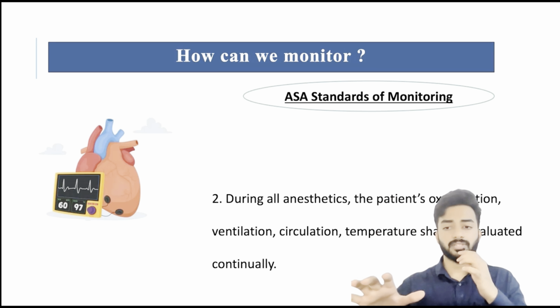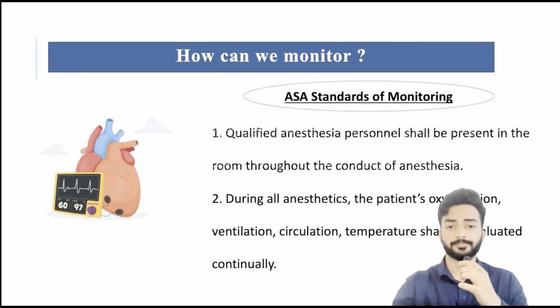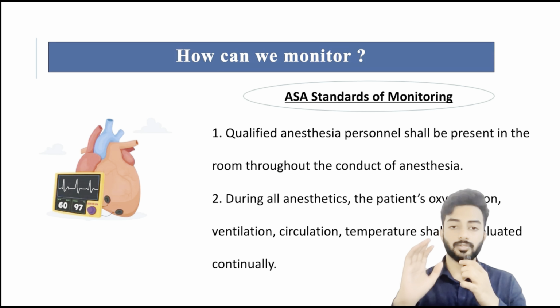So is this enough? Just shifting the patient inside the OT and connecting the monitors. Is this enough? So they have given us standard 2 monitoring. So what is standard 1 monitoring? A qualified anesthesia personnel shall be present in the room throughout the conduct of anesthesia. So they have given us standard 1. You should not just attach the monitors and leave. There should be an anesthesia personnel present throughout in the OT.